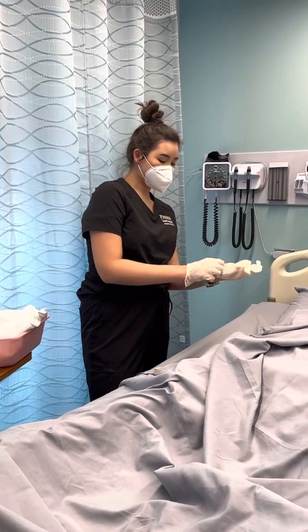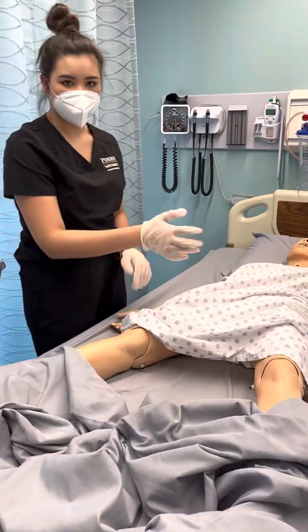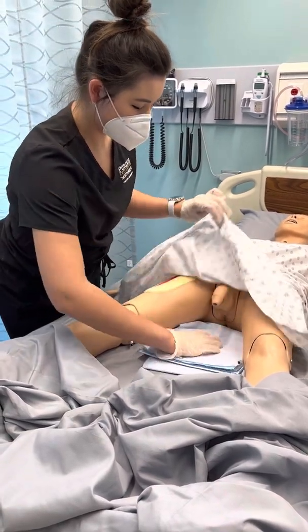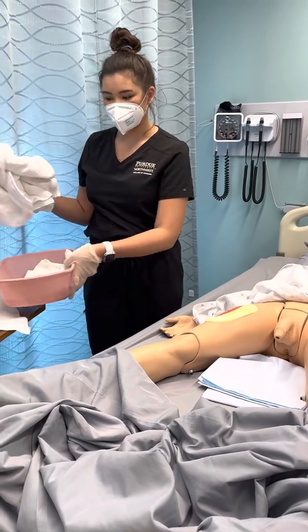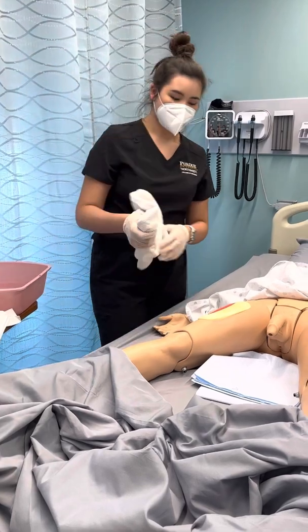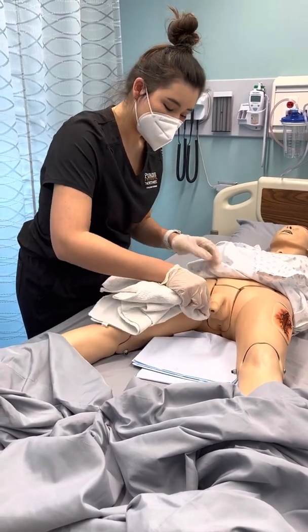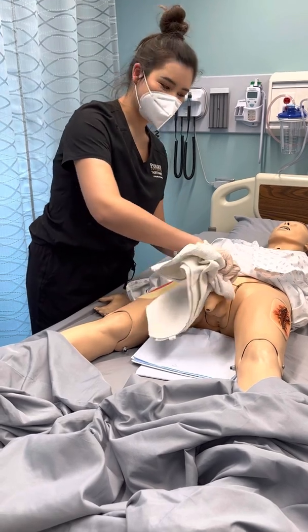So then after that, I'm going to get a chuck and put it underneath them. I'm going to try to maintain modesty. And then I'm going to clean them using some washcloths and decently warm water. The first thing I'm going to do is clean the penis and then go downward. Each time I'm going to change the area of washcloth that I'm using, and I'm going to use downward strokes on the shaft.